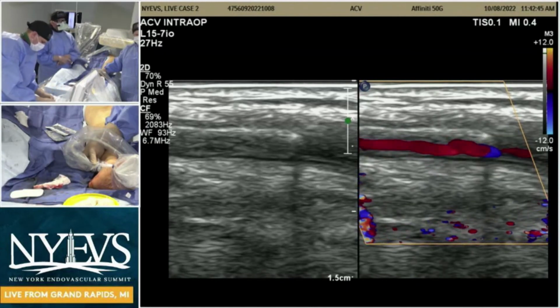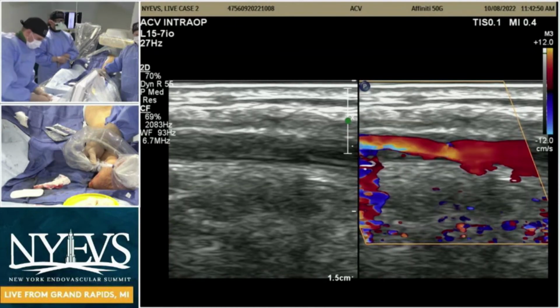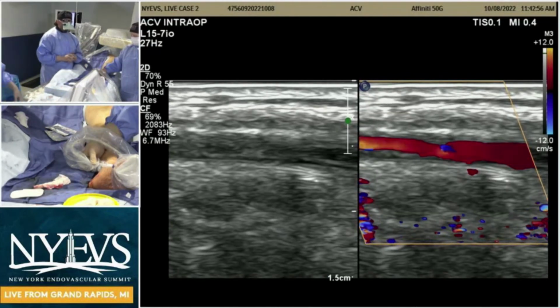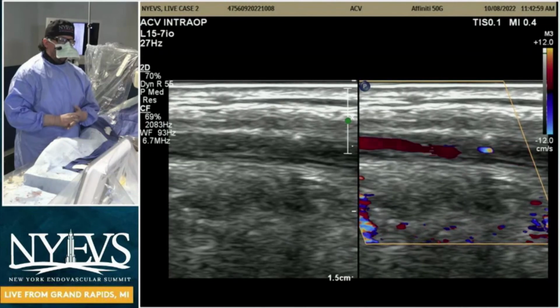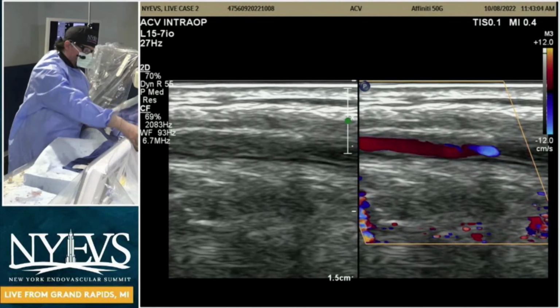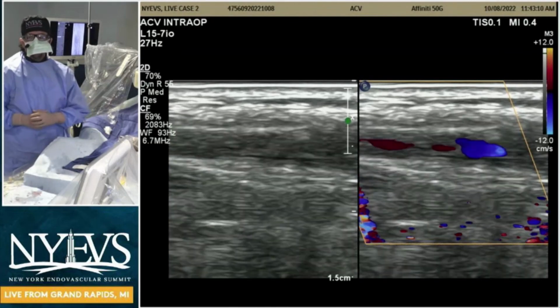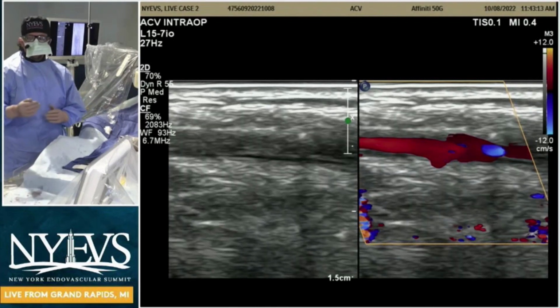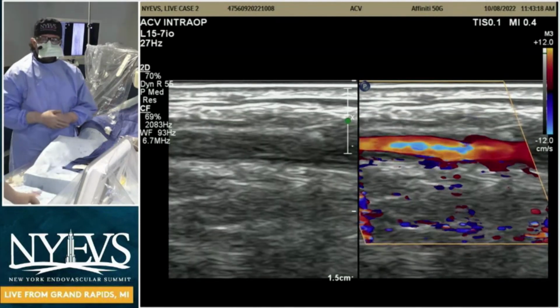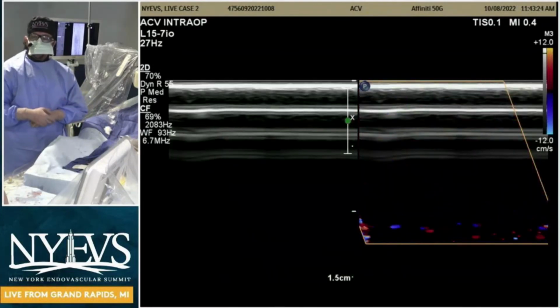Now, I will say that I always try to protect my peroneal access by placing a sheath, because we get in trouble if we just work sheathless. You can get away with it, but based on the hundreds of cases that we've done, the complications that we had were when we did not have a sheath. So we will utilize an integrated approach, ultrasound guided. We use a longer needle. We would really rarely use the peroneal as a TAMI technique, so we're usually using it in a CLI patient for revascularization of proximal disease. And we tend to do hemostasis with internal balloon tamponade.